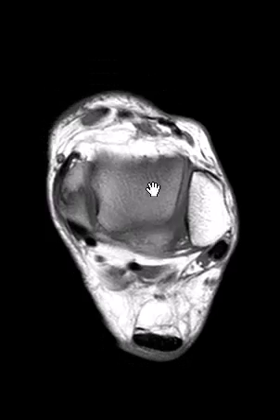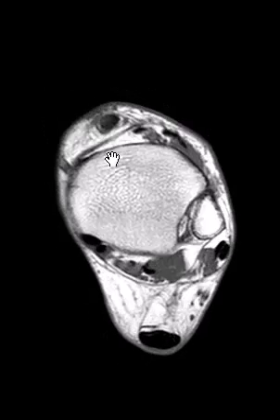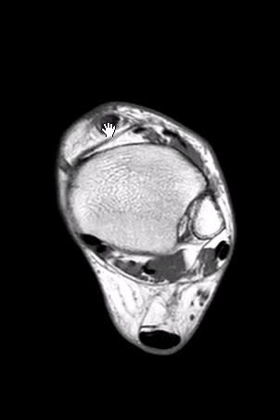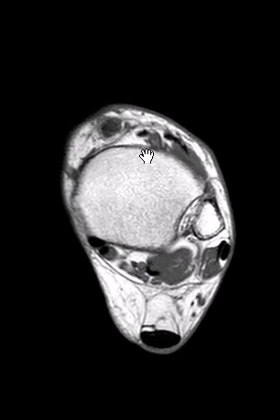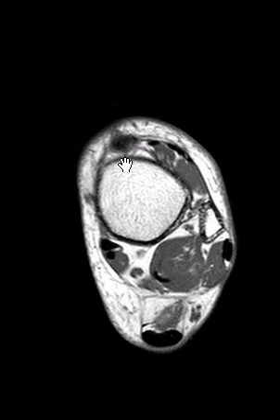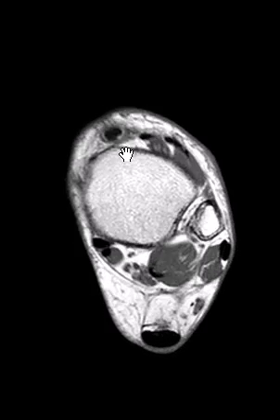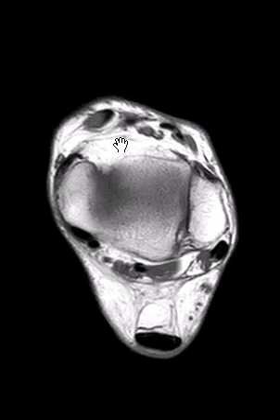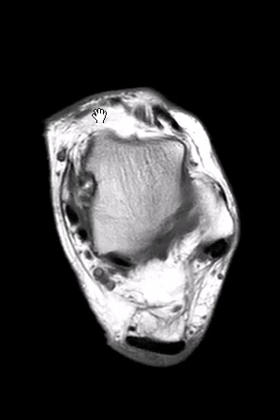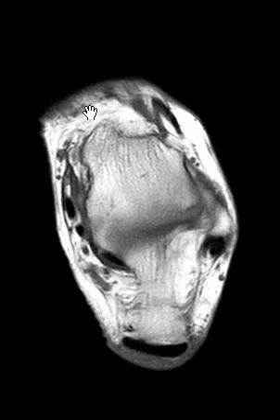Now we run to the front. On this side, we should see the anterior tibial — there it is right there, not looking too good. It's a little too thick. We have the extensor hallucis, this little one right here, and this broad thing is the extensor digitorum with the muscles underneath. The anterior tibial doesn't look quite right, so we start up high. It looks almost normal here, but as we come down it looks funny — too gray. We get down here and it just looks too gray; it should be the biggest, darkest one. Instead, we don't see it at all. So it's ruptured.